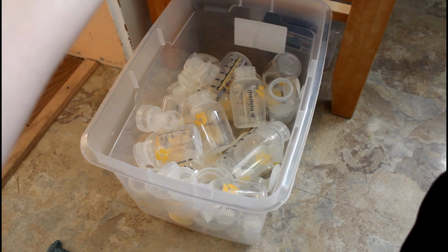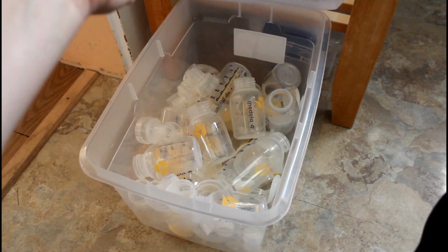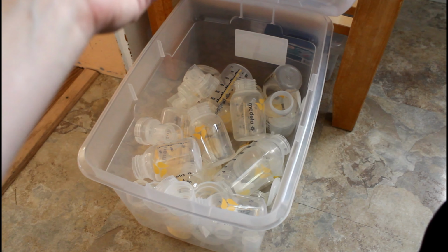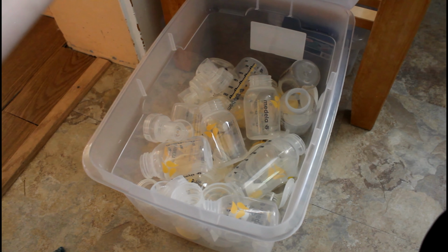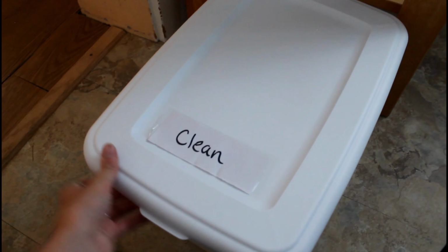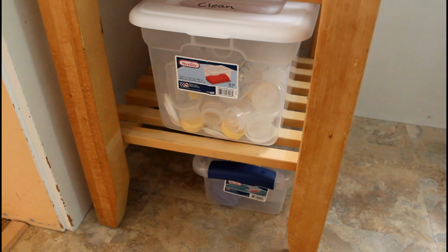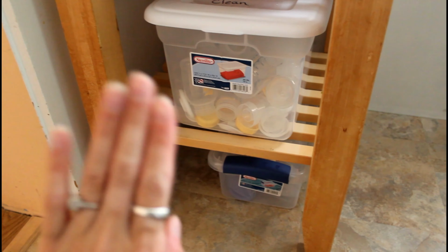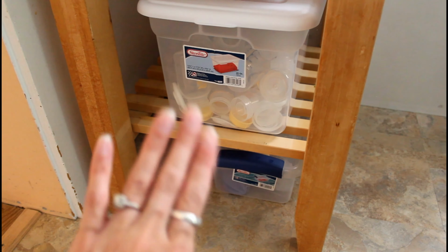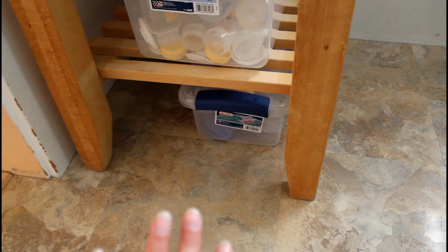So there are a ton of parts in here. I'm not going to touch any because they're all sterile, but I have a set of 6. So I have 6 sets of everything. There's a lot of pump parts in here, and I also have extras in here that are sterile and clean. This just says clean on it. So that just lives in there, and whenever I need fresh pump parts that are clean so I can have my pump session, I just go right there. And down below I also have another bin.